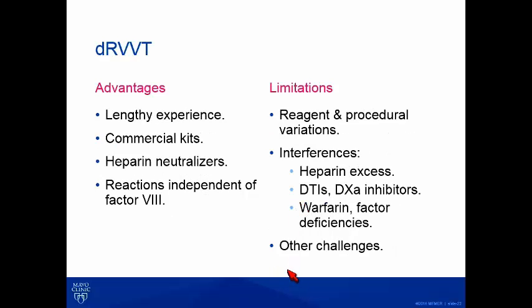How about the DRVVT? We don't do as many of those as we do with the PTT, but we still have a pretty lengthy experience with the test. There are commercial kits, and many of those commercial kits contain heparin neutralizers. As I mentioned, the reactions are independent of factor VIII inhibitors or activity because it's downstream.